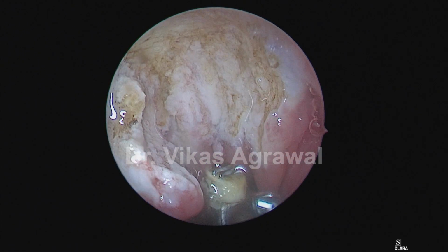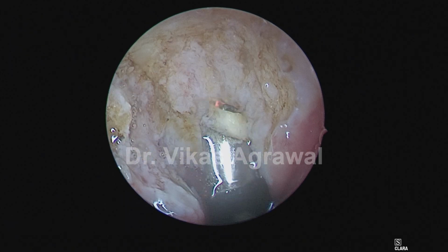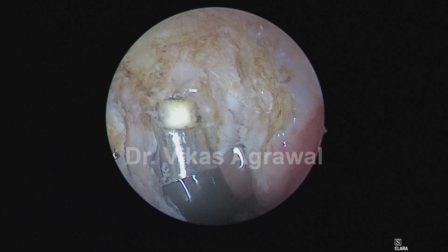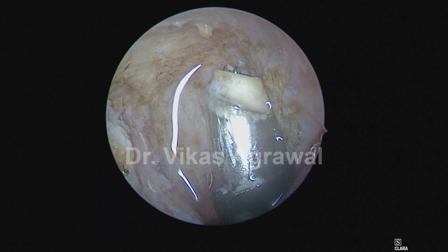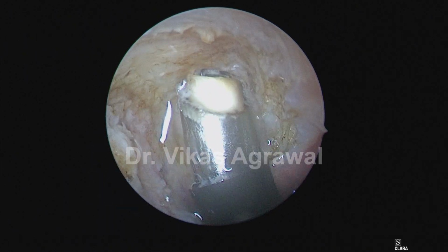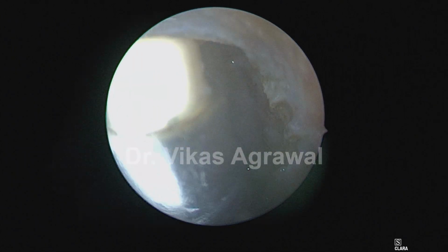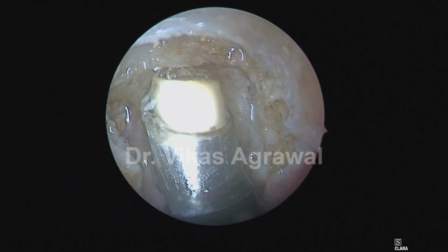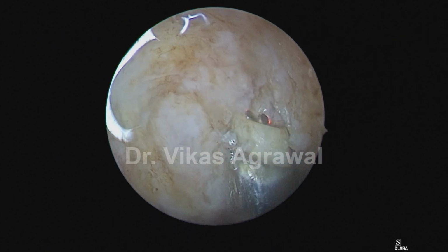Now we'll keep on removing tissues layer by layer. That is the periosteum below the sphenoid bone superiorly. Now that's the fossa of Rosenmuller laterally.